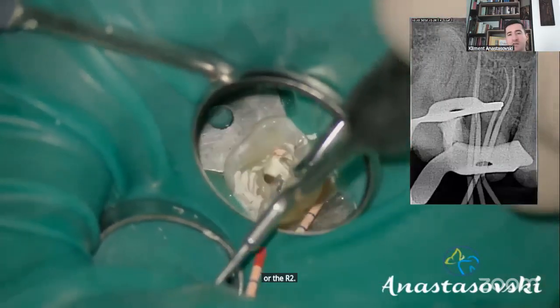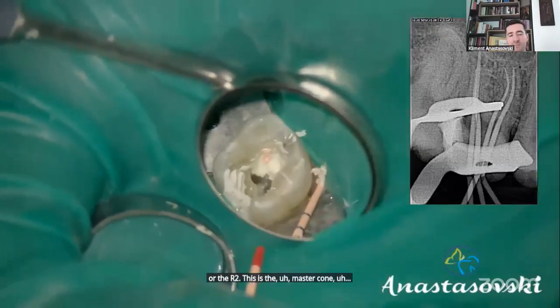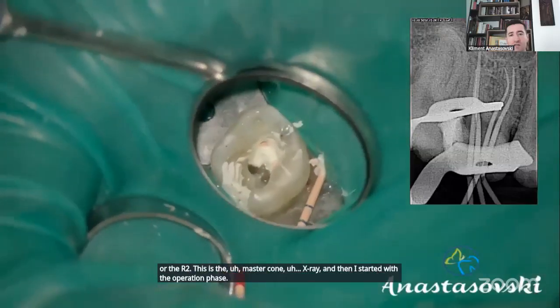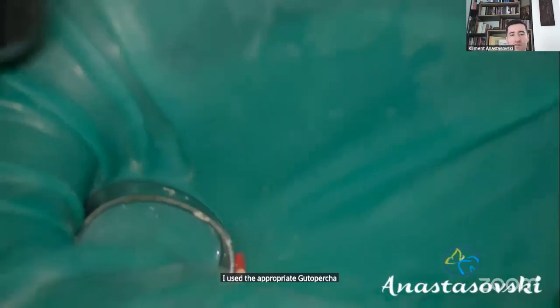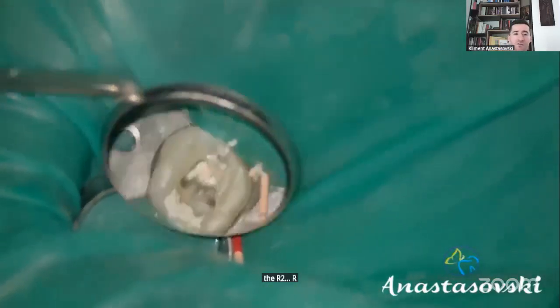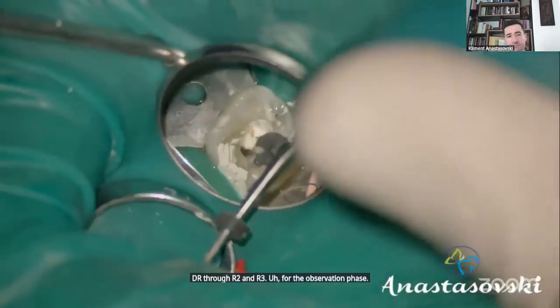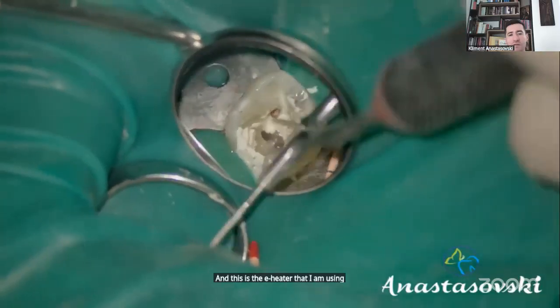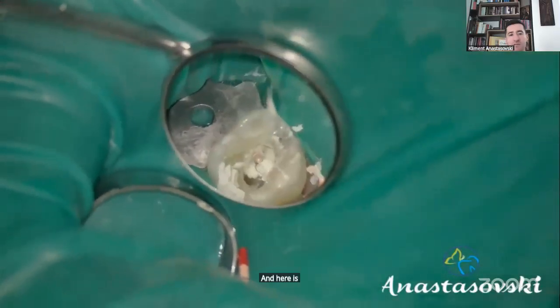This is the master cone X-ray, and then I started with the obturation phase. I used the appropriate gutta-percha cone for the Rising file system, the R2 and R3, for the obturation phase. And this is the e-heater that I'm using for the downpack. And here is the hand plugger.